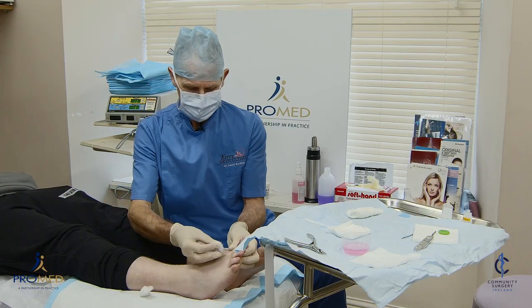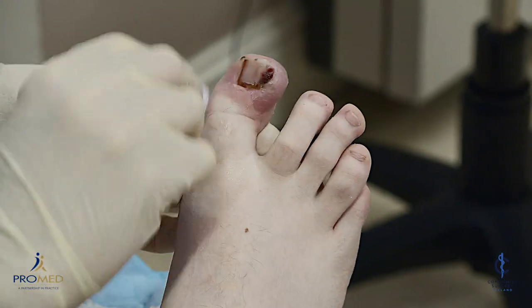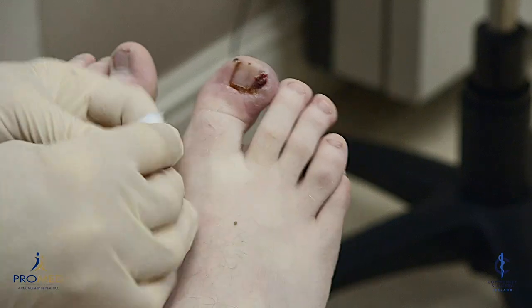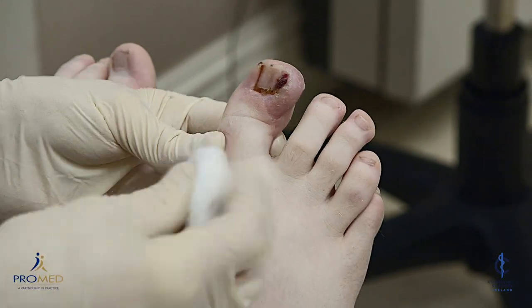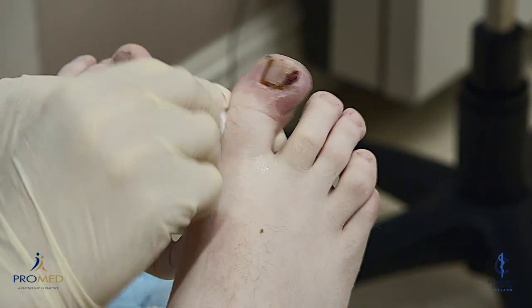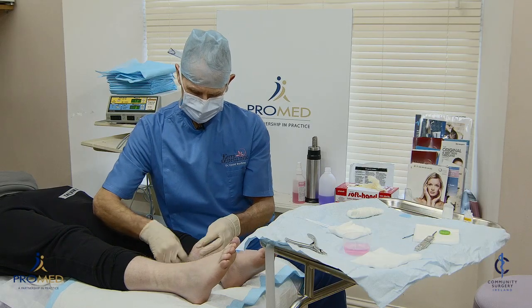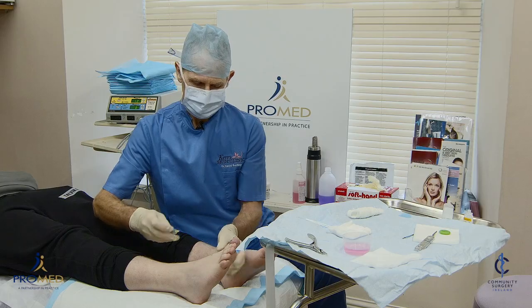We're going to demonstrate how to do a ring block anaesthesia first. We clean the skin with some methylated spirits and then some chlorhexidine. The most important thing is that you protect your hand when giving the anaesthetic — you have to be careful.